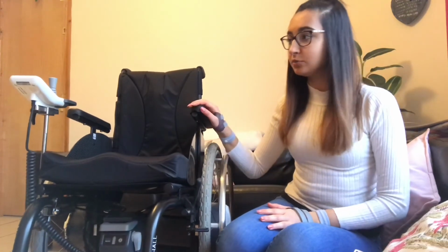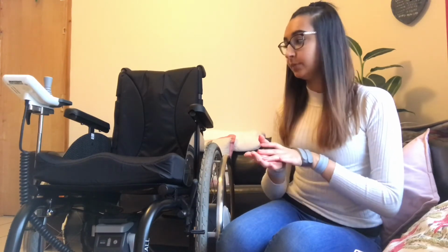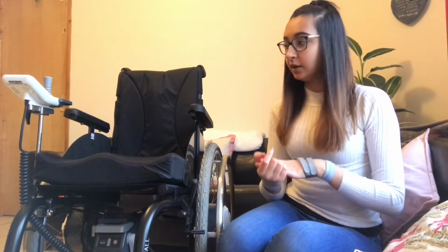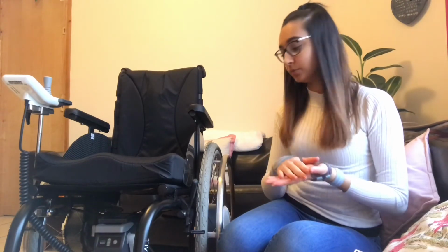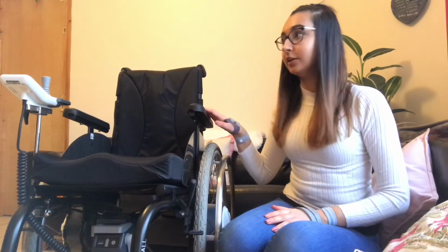I don't think there's much more to say about it other than you can adjust the speed. You can't really tip up to do a wheelie. That's the biggest thing I found. So curbs can be difficult if the drop curb isn't quite dropped enough. But overall, I'm getting on with this chair so much better than the other one.